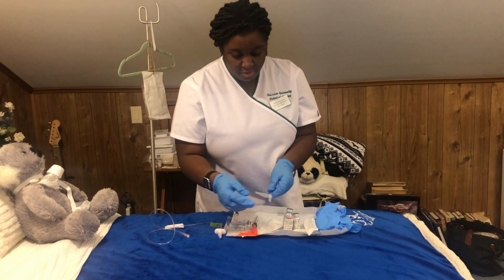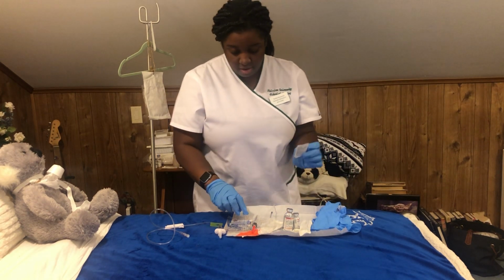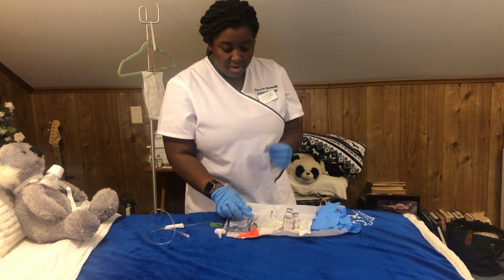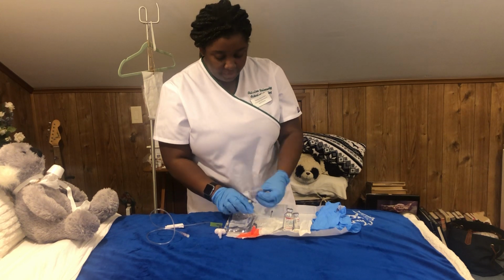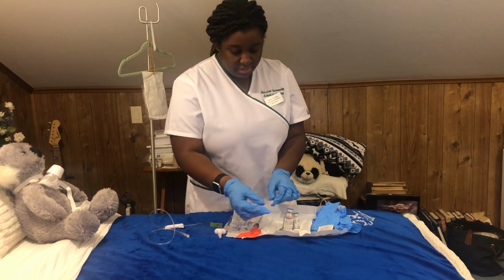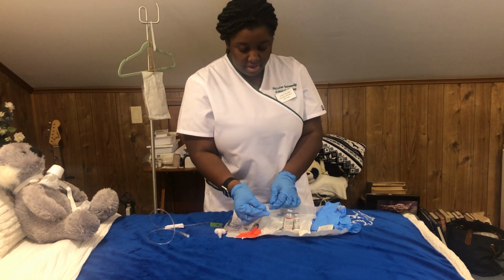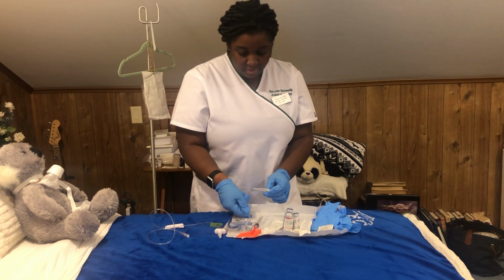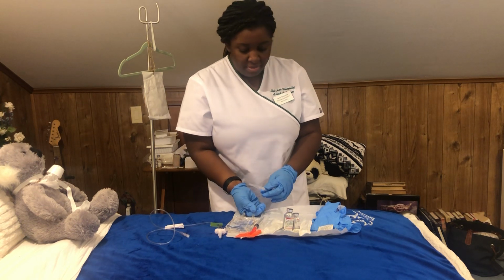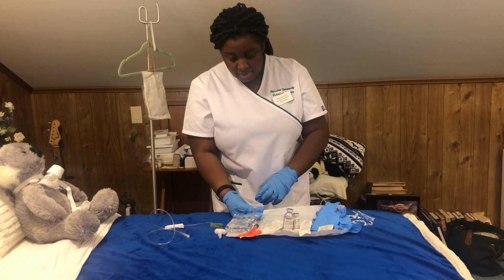Okay, so in order to perform another aseptic technique, which is to clean off the IV piggyback port, I'm cleaning off the white part. Okay, so I'm just doing that, making sure that it's there. On a flat surface, I will uncap my medication again, doing one final check to make sure it's the correct patient, time, medication, dose, and frequency, and inserting it into the port.